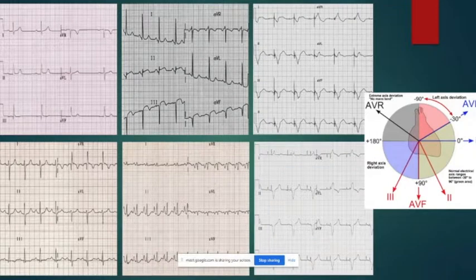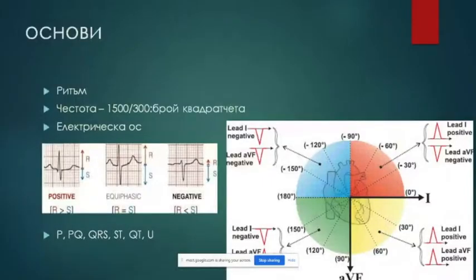Cardiac axis? Yes. This is one of the most difficult things to define for students and for some doctors, of course. It was quite difficult for me as well. But let's see how you do it. I have given you the triangle, and there are some examples. So, these two figures are a way to help you define the axis. So, how can you define the axis? Of course, there are several ways, at least two. I can think of them now, but I usually use the way I've shown you in this presentation, so I'm not using any other.